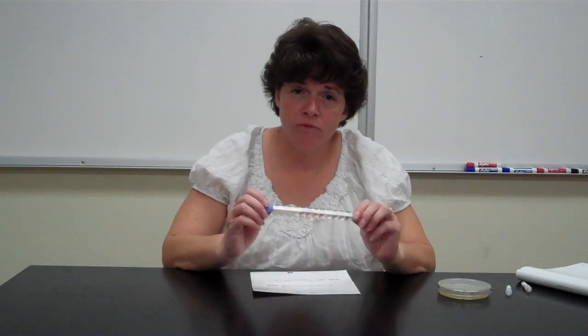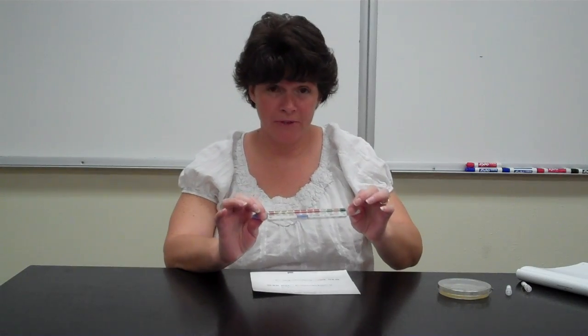And this is really a fun test for a couple of reasons, because the color changes are pretty, but it's like actual real tests that would be done in a lab, and you get multiple results at one time, and it's usually pretty accurate. And when you see the book that I have, there's multiple codes that will work for one bacteria, and it's pretty specific. So it's a nice test because you get those specific results. And so that's the Enterotube, the multi-test system.